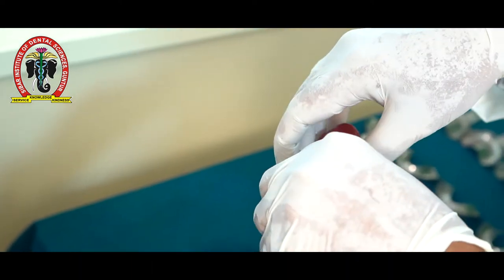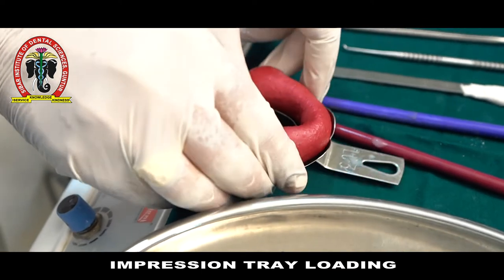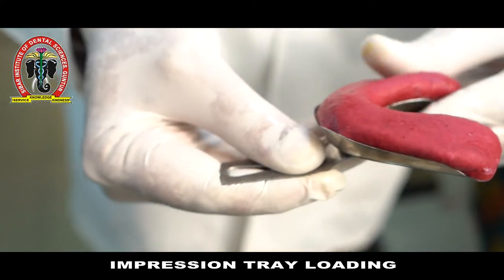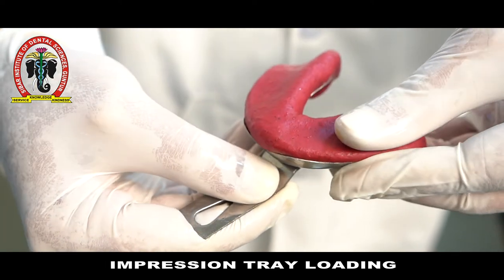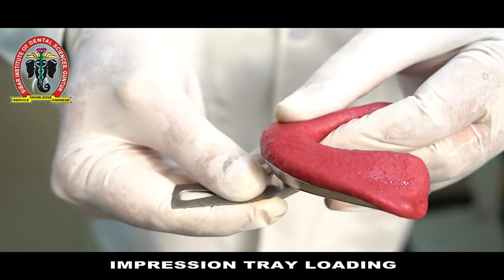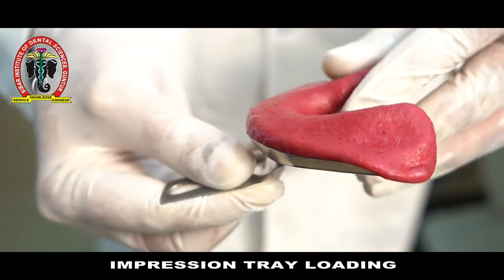Knead the material, then stretch it and adapt it to the tray. Load the material such that you have more material in the distolingual area and less material on the facial side — that is in relation to the labial and buccal vestibular areas. Since the distolingual vestibular depth is more, load more material in the distolingual area and less material on the facial, labial, and buccal vestibular areas.